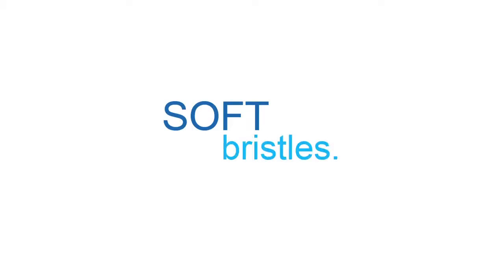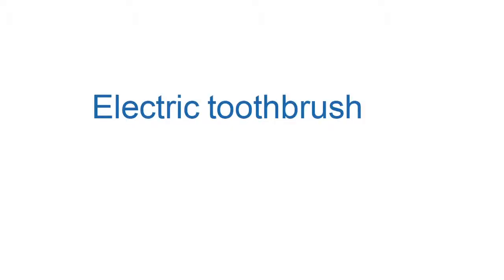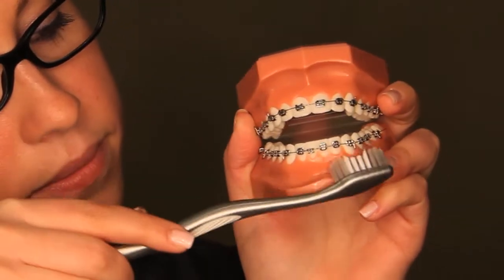Before you begin to brush, select a toothbrush with soft bristles. Toothbrushes today are orthodontically contoured with a channel cut out so the bristles in the center are shorter, allowing you to brush your teeth and braces simultaneously, keeping both clean. Electric toothbrushes also have an orthodontic head. Brushing on an angle aids in cleaning above and below the wires.